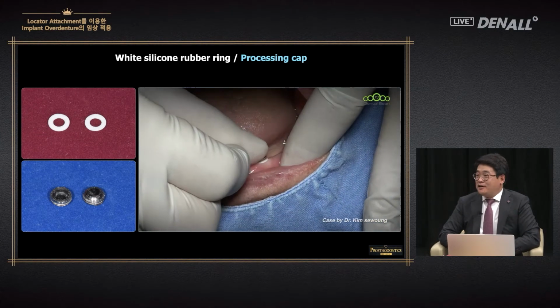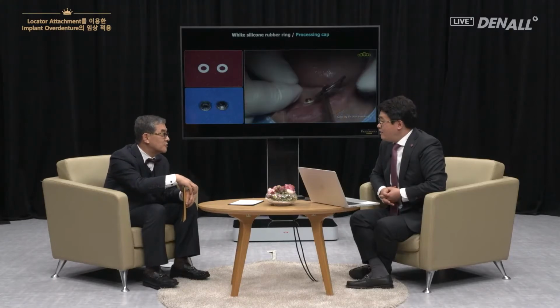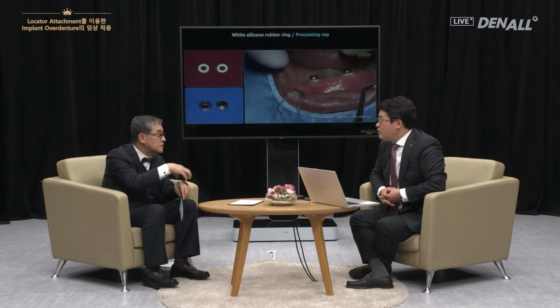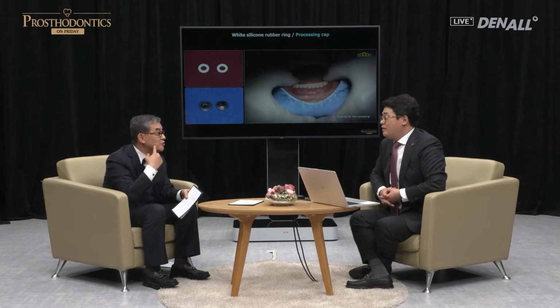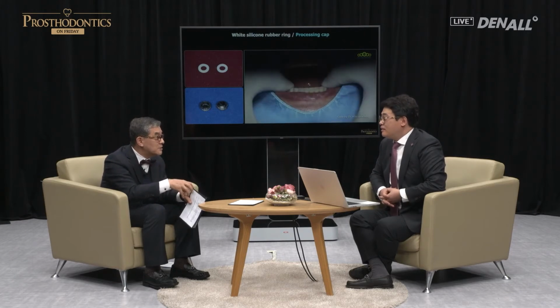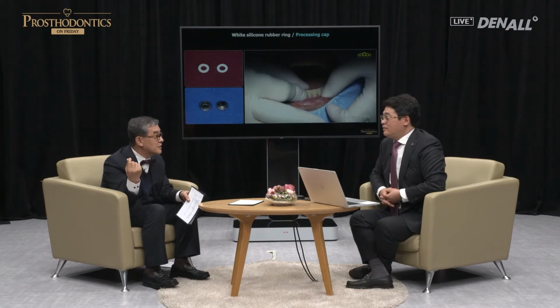How did you block the resin out when these were not available? The primary purpose is to prevent it from going in. And then you can see that it is coming out there. There's a bit of space, and I believe this also gives legroom in terms of vertical movement. Because there's a strong tissue support, it sort of rocks back and forth. If you make it fit, it is concentrated on the implant and it moves together. And at times we call that space.